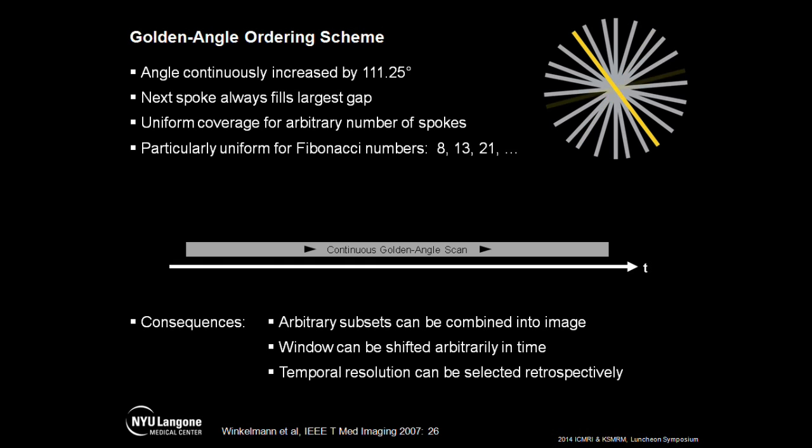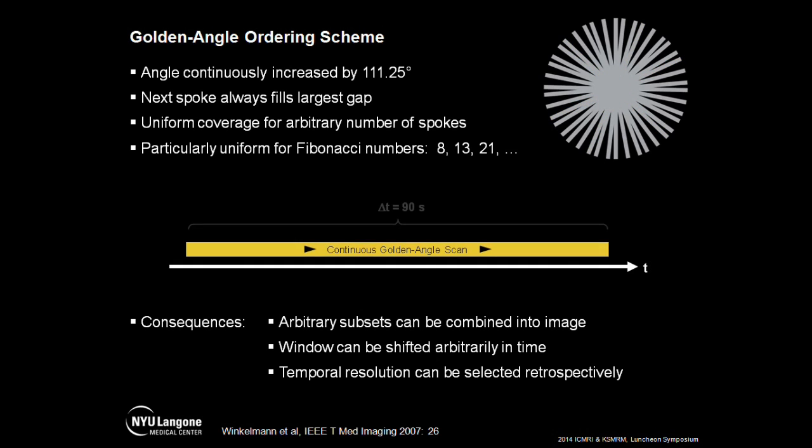And that means we can basically do one continuous scan, and we can then either take all the data, all the spokes, and reconstruct a single image from all the spokes, or we can take any subset of these spokes and reconstruct an image from a shorter time window.